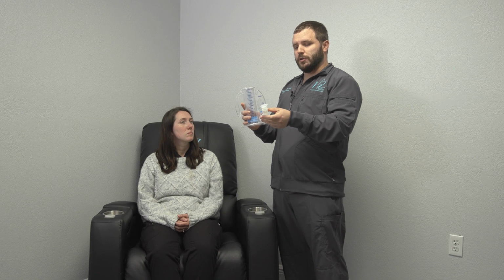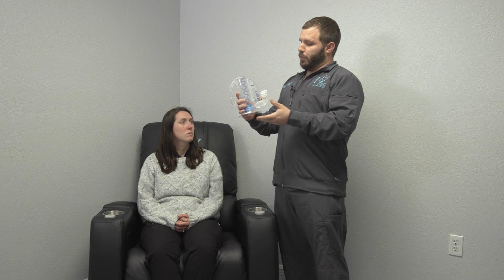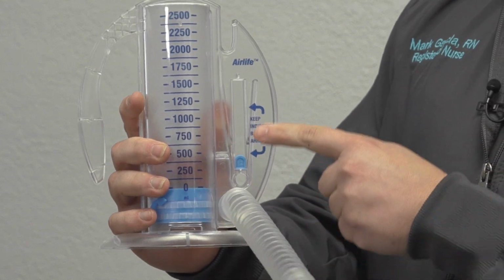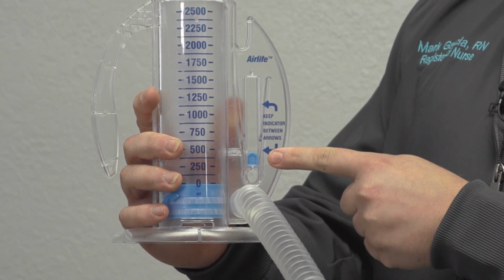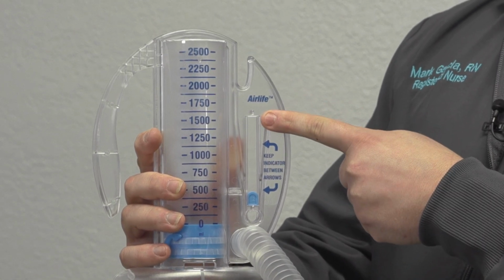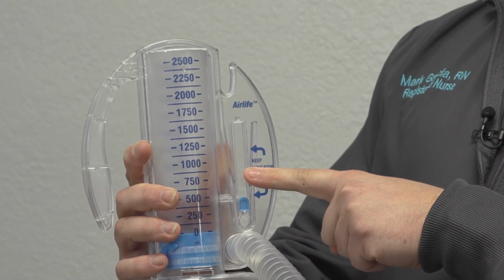The mouthpiece will sit right in the patient's mouth. They're going to take in a nice, steady, deep breath. As they're taking in that breath, they want to ensure that this little blue tab is floating just in between the two arrows on the device. If the tab is above the arrows, that means they're breathing in too fast. If it's below the arrows, they're breathing in too slow. So they want to keep it floating just in the middle.